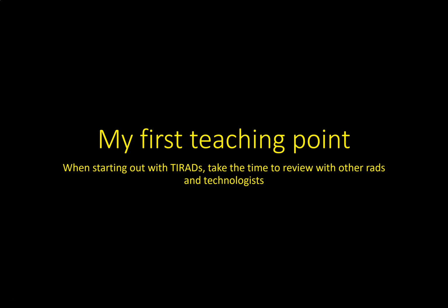Now, in my experience, TIRADS has been an excellent addition to my thyroid ultrasound reporting. It has streamlined my reports, and anecdotally, I believe there has been reduced follow-up and reduced biopsies. But this is probably related to a number of factors other than TIRADS. Regardless, I believe my reports have added value now with specific guidance to go with my descriptions.